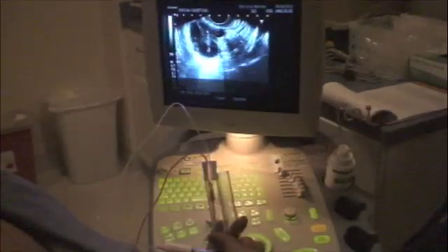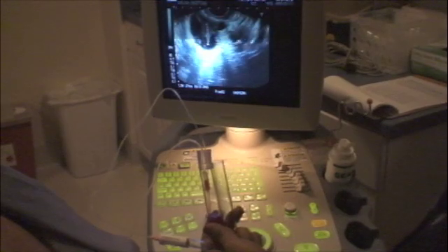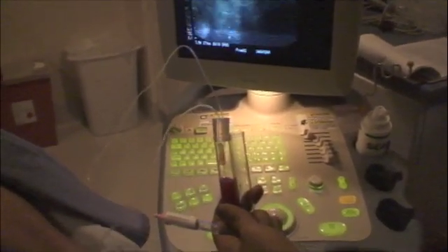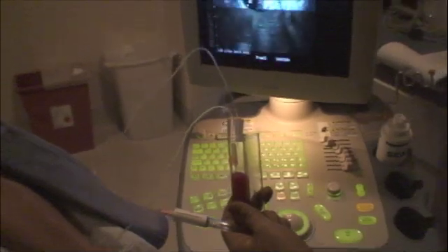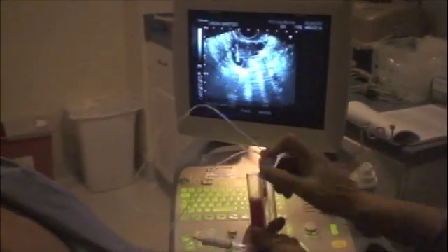Once the needle's in the ovary, I can move it between the individual follicles. There's a foot-activated suction device that will pull the fluid out of the individual follicles, and that fluid ends up getting collected in the test tubes that you can see here.